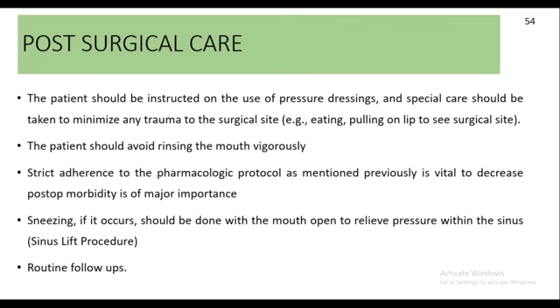and special care should be taken to minimize any trauma to the surgical site. The patient should also avoid rinsing of the mouth and strictly adhere to the pharmacological protocol. Sneezing, if it occurs, should be done with the mouth open to relieve pressure in patients with a sinus lift procedure, and routine follow-up should be called every 3, 7, and 10 days.